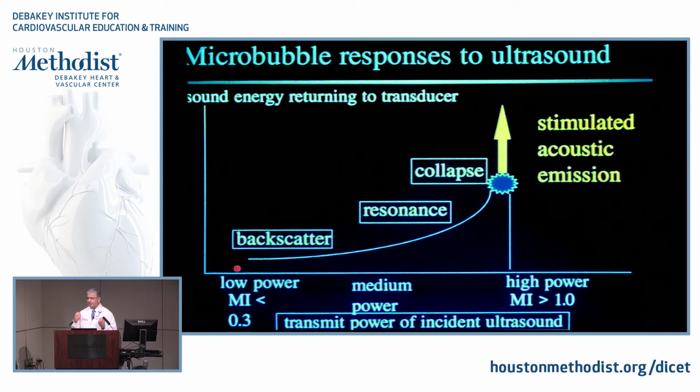So if a sonographer makes a mistake and stays at a high mechanical index, my eye is not always on the mechanical index, but my eye is on the echocardiogram, and if I see contrast that is funny, that is not filling the whole heart smoothly, I always look there and see what kind of setting somebody is using. So hopefully the sonographers are tuned into this at this stage of the game to know what to do and what not to do.